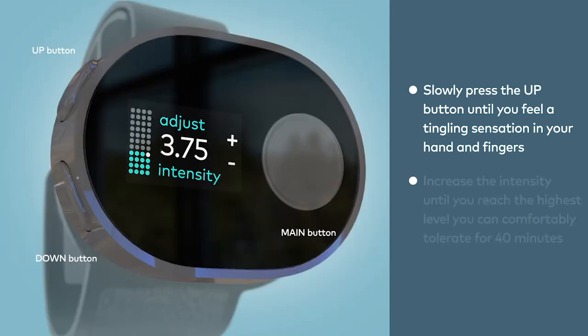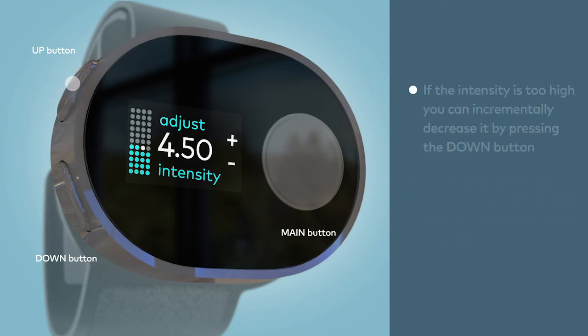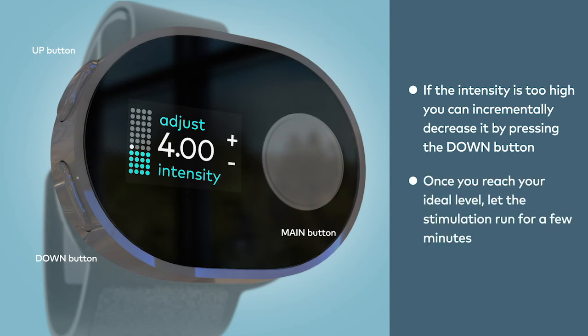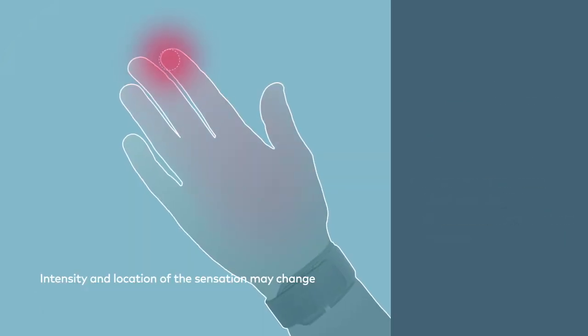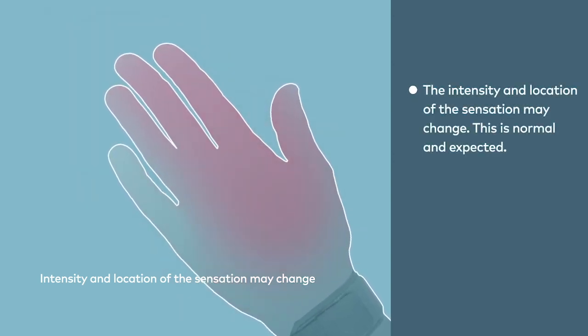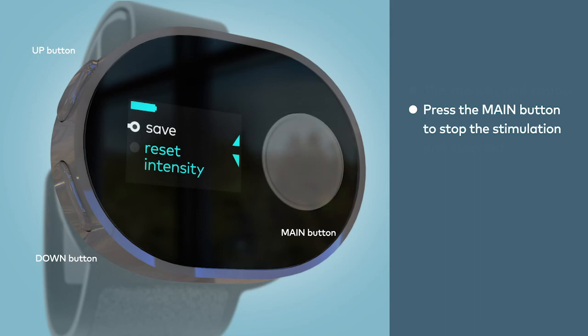Continue to increase the intensity until you reach the highest level that you can comfortably tolerate for 40 minutes. If you feel the intensity is too high, you can incrementally decrease it by pressing the down button. Once you've reached your ideal level, let the stimulation run for a few minutes. You may notice that as you move your hand around, the intensity and location of sensation can change — this is normal and expected. When you're happy with the intensity level, press the main button to stop the stimulation, then press the main button again to save the intensity preset.